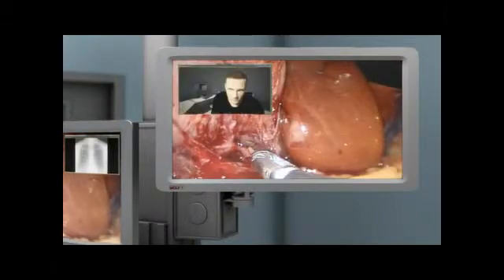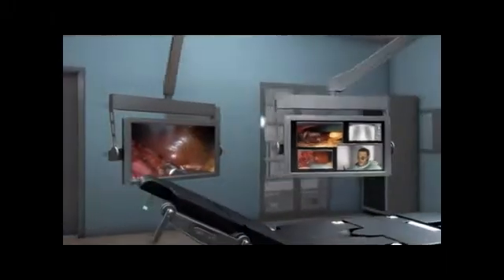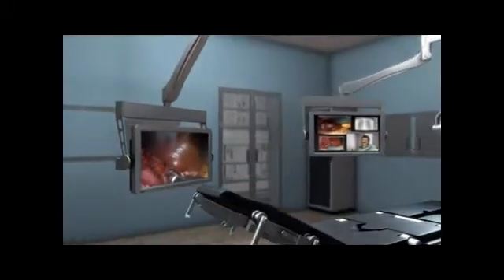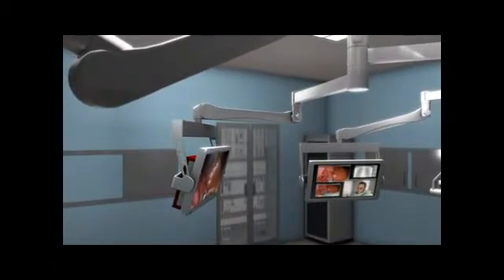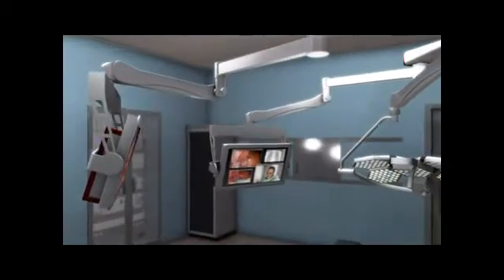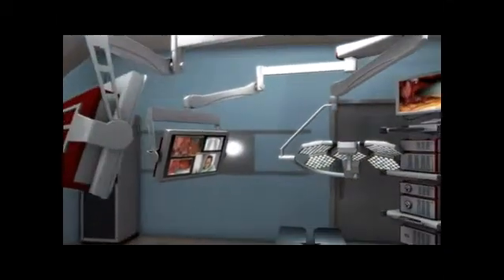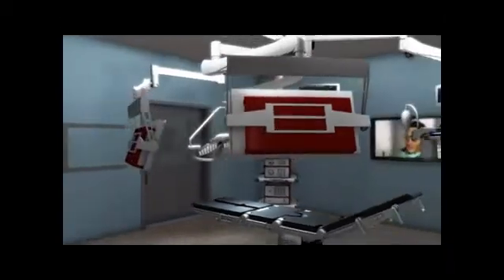All available image sources — endo cameras, even a dedicated operating theatre camera — are suitable for this application. Any image can be called up on any monitor, just as the surgeon needs it. Mounting monitors on the tripod allows them to be set up at virtually any position in the room. This media control allows surgeons to switch the image signal to the preferred monitor and is independent of the system.